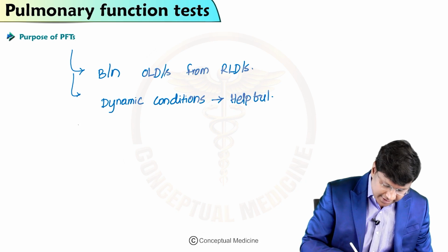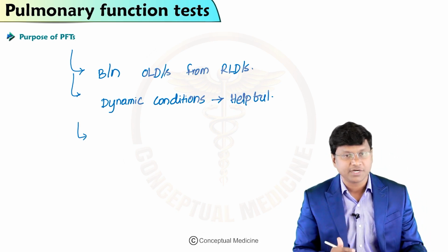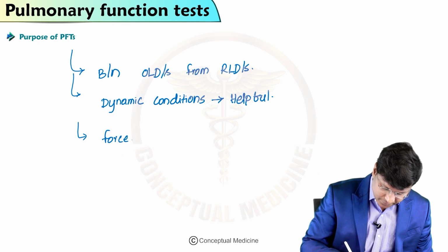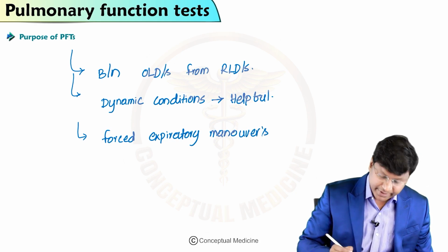Now, out of all the various parameters, which is most useful? This is an important multiple choice question. Forced expiratory maneuvers.